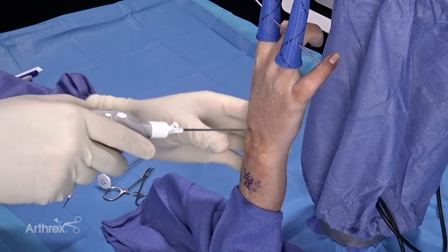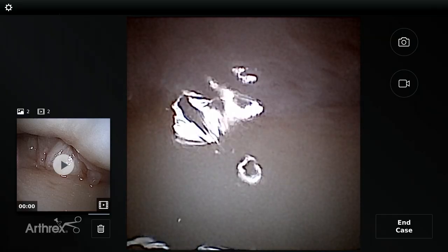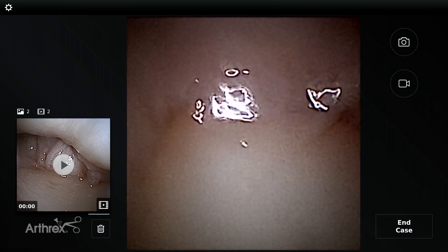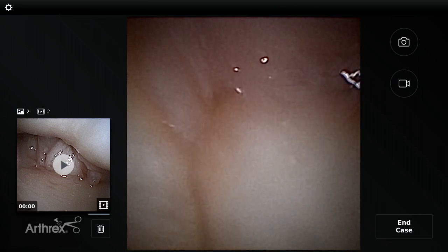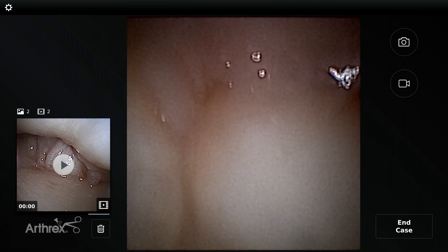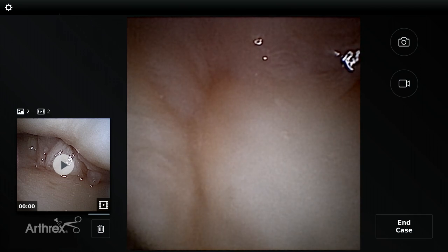Now you'll see we're in the midcarpal joint — a very tight joint with no cartilage injury — putting the 12-gauge needle in. What we're looking at is the lunate and then the scaphoid, so we're right over the scapholunate articulation. This is something you can even do in the clinic with the joint numbed up, just to get an immediate view of dynamics and scapholunate instability.